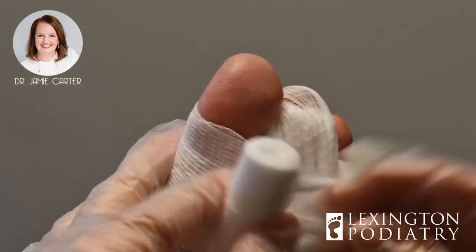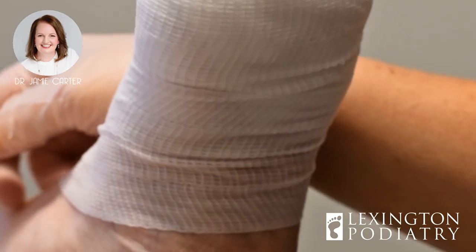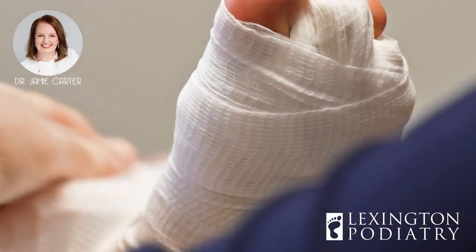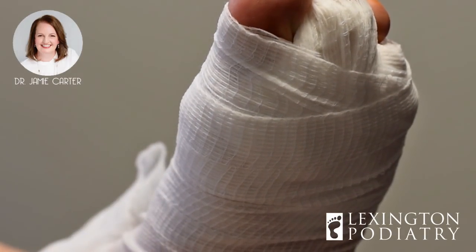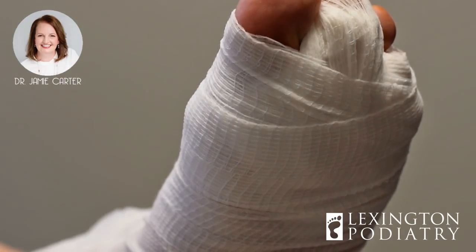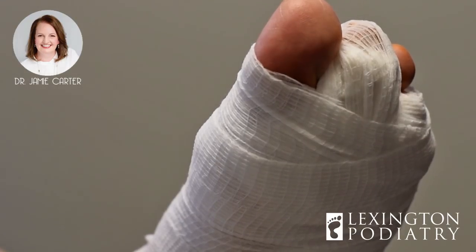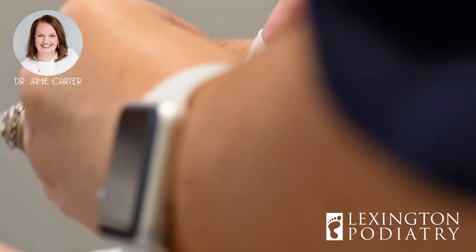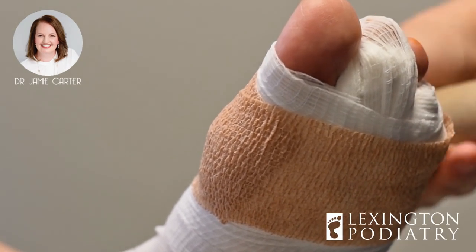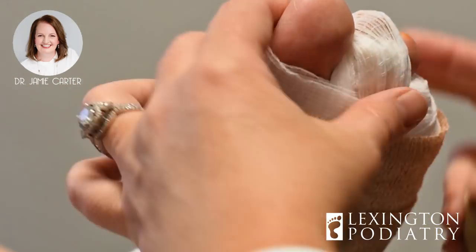I will cover it — a lot of times people don't like to see that toe sticking up. You did great, you're going to be a pro with this. You have to take it off — you're going to leave this part intact but you can take off this coban. So I'm just going to lightly put this around here, something that will help to hold this on. Reducing the chance of you peeling it off is putting a knee-high on over top of it and just leaving it on. I'm not going to do it very tight, just to kind of hold it on. Does that look okay to you? Perfect.